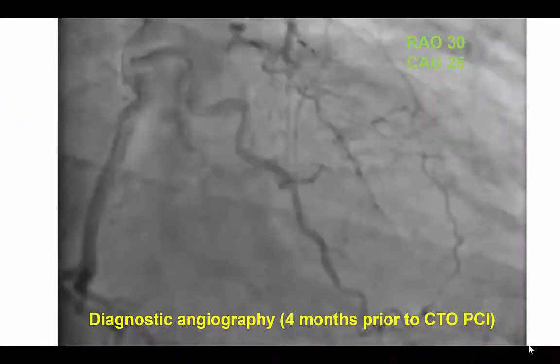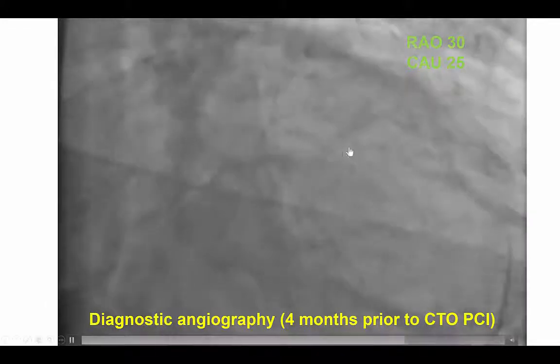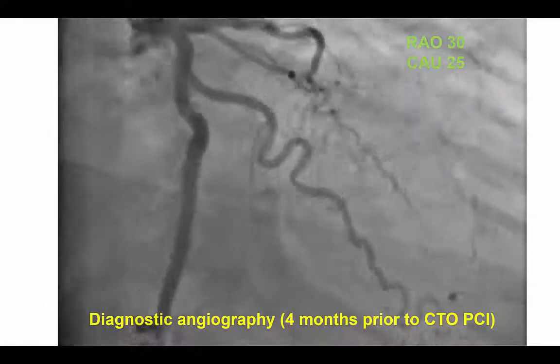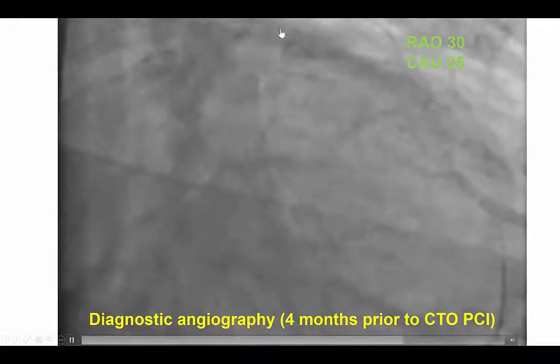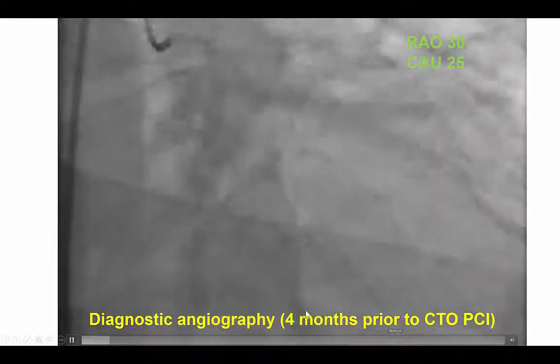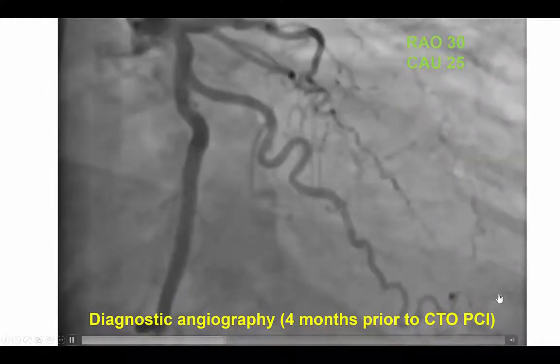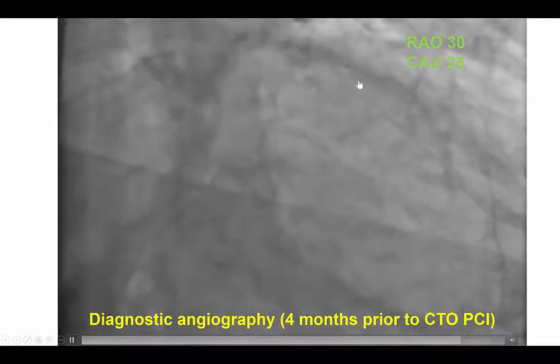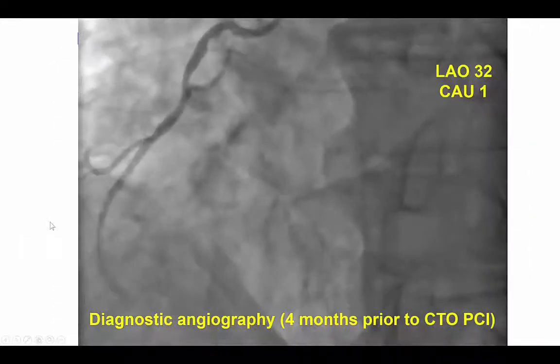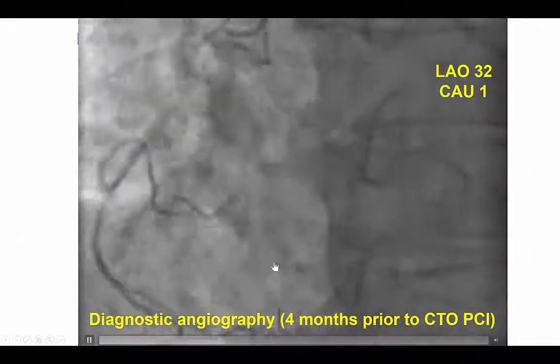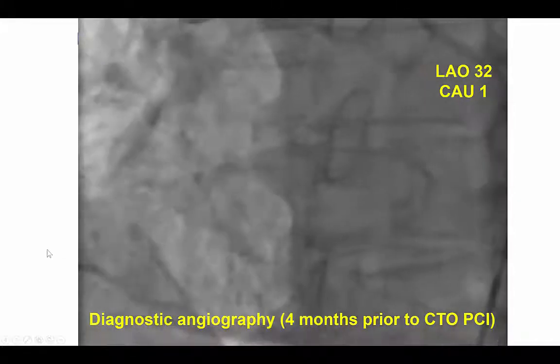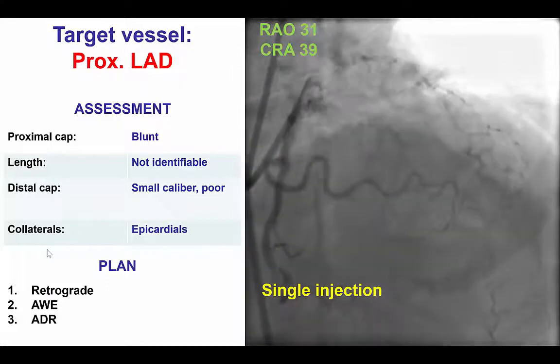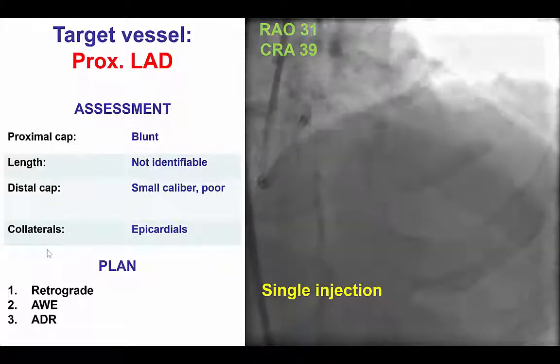This was a patient referred to us for PCI of an LAD CTO. A diagnostic angiogram done about four months prior to the present attempt showed that there were collaterals from the circumflex filling the distal LAD. However, there were no collaterals coming from the right coronary artery supplying the LAD. Given that there were collaterals from the same side, we decided to go with a single guide catheter.